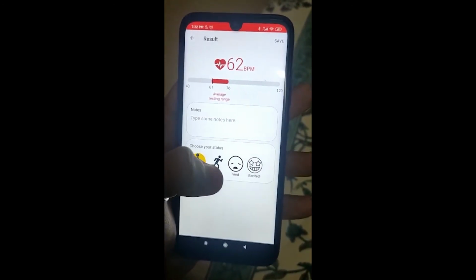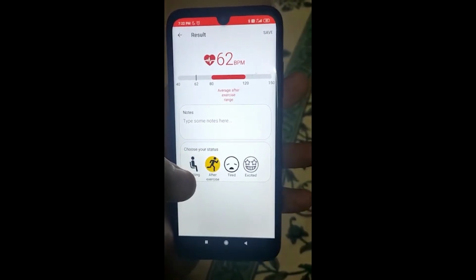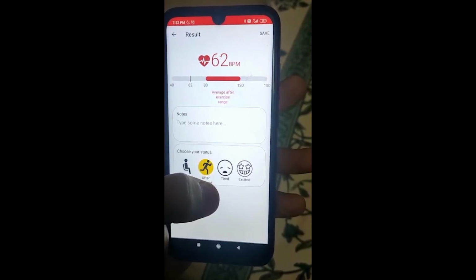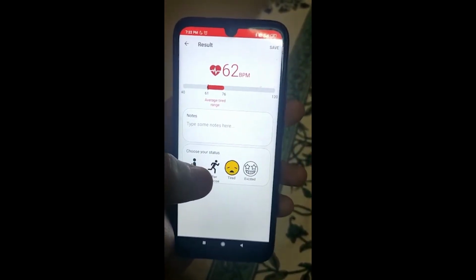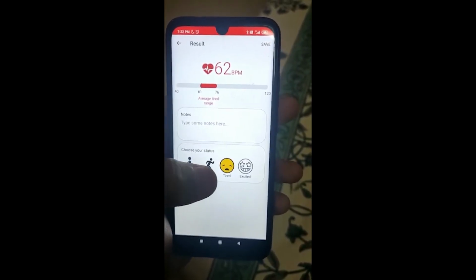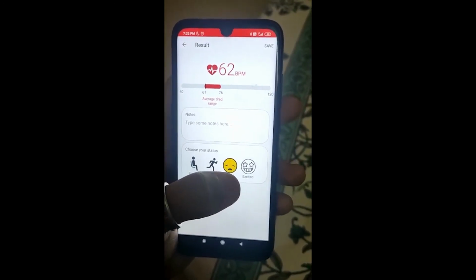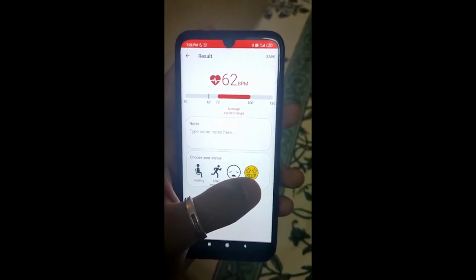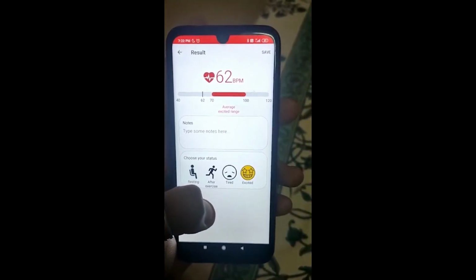So now if we click on after exercise, if we have calculated the heartbeat after the exercise, we can see the average range after exercise should be between 80 to 120, and ours is 62, which is quite less. If we are tired and we calculate the heartbeat per minute, we can see that the average tired range is between 61 to 76 and ours is 62, so that comes within the average range. And similarly, in case of excited, we can see the range is from 70 to 100.